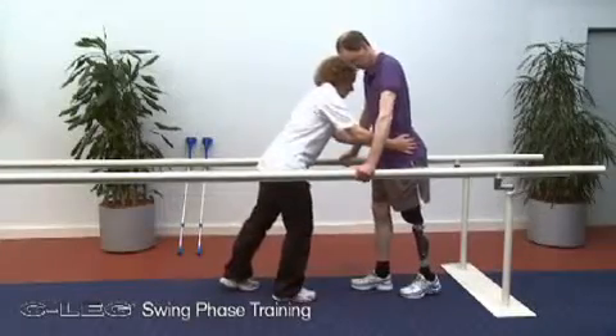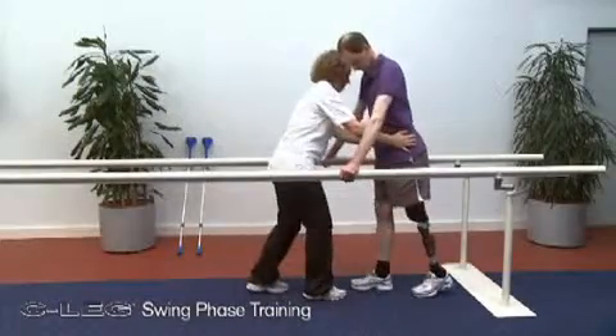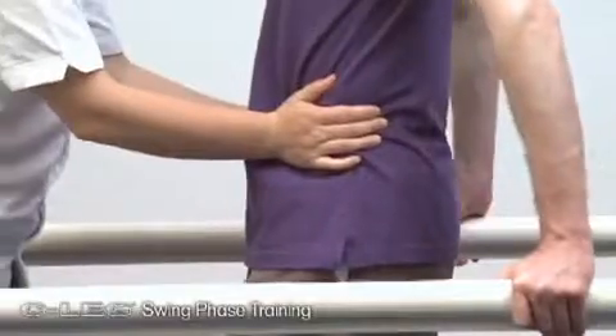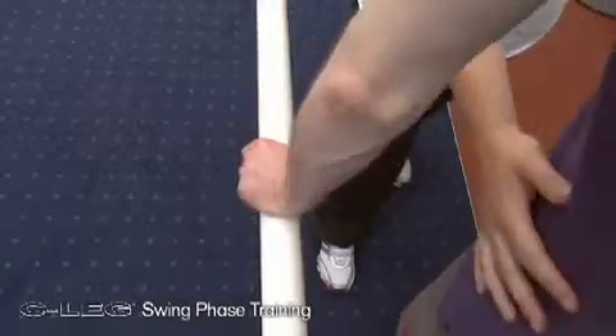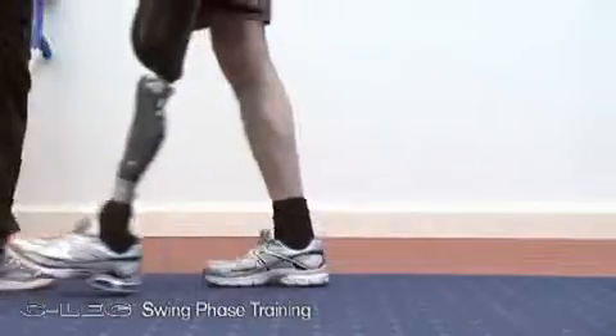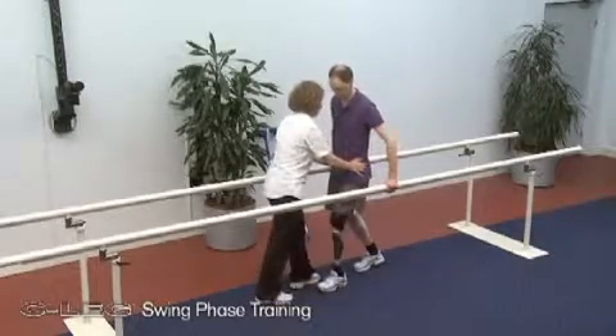It's important that this be practiced initially with the user standing between parallel bars. Please note, however, that walking with forearm crutches or excessive support on the parallel bars can lead to problems. If too much weight is borne by the supports, the required maximum load on the prosthesis cannot be reached.